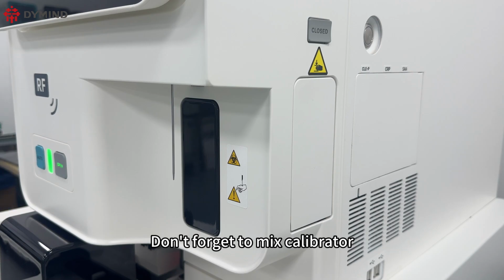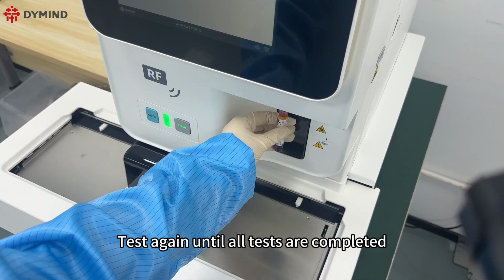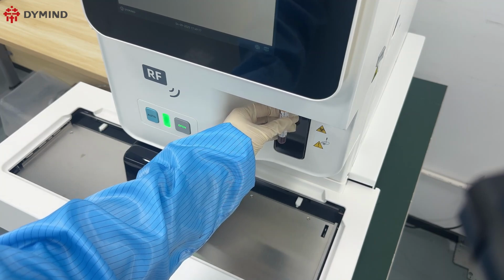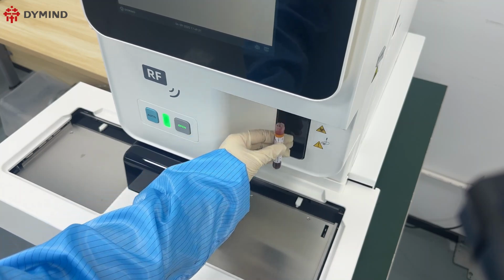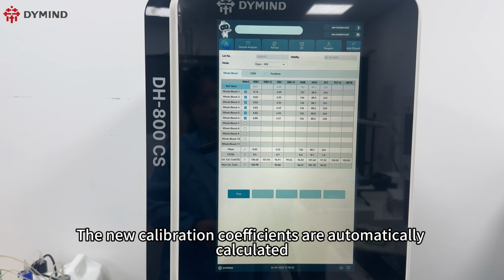Don't forget to mix calibrator. Test again until all tests are completed. The new calibration coefficients are automatically calculated.